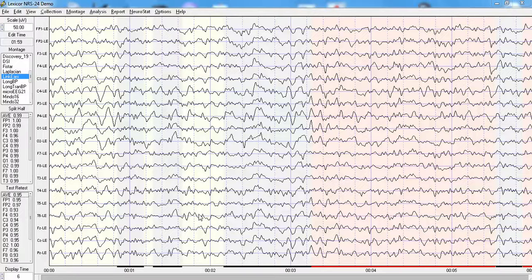The other is called functional connectivity, which gives you correlations or coherence of coupling between distant nodes, for example, of networks, and gives you a measure of the extent to which there is a coupling between nodes or locations on the scalp surface. The third form of connectivity is referred to as effective connectivity, which is a measure of the magnitude and direction of information flow in coupled nodes of networks, or if they're not coupled, then there will not be any information flow.